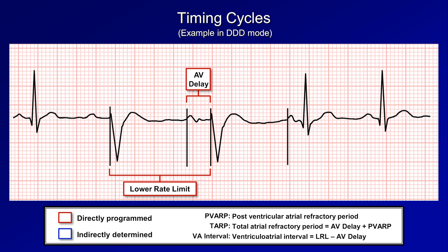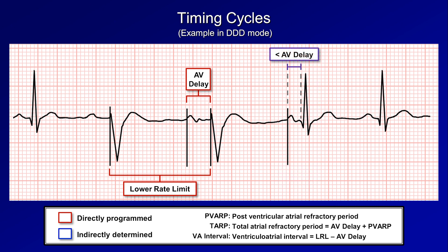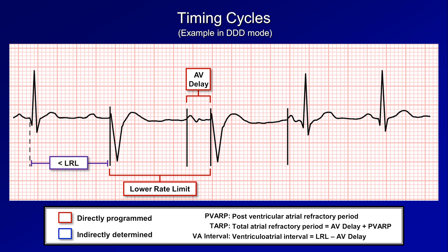Sometimes the timing intervals initially appear different than programmed. For example, with an A-paced V-sensed beat, the PR interval is less than the AV delay. This happens because AV conduction occurred naturally and happened to be shorter than the AV delay. Likewise, the interval between two successive ventricular depolarizations can be less than the lower rate limit interval — here, because the naturally occurring P wave happens sooner than the VA interval expires.